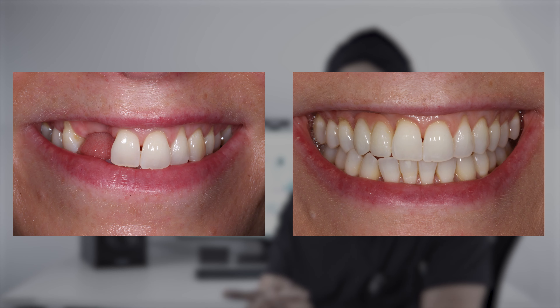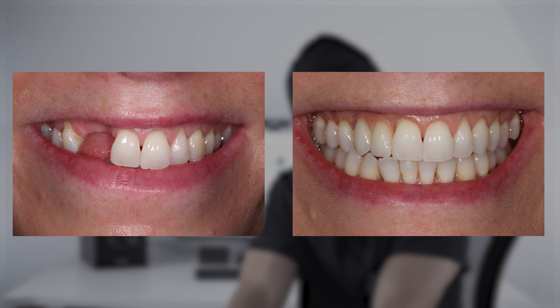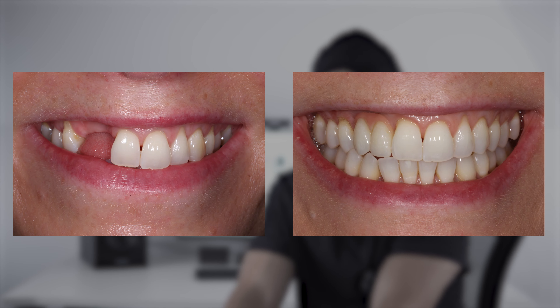How about when we're having a smaller treatment, let's say one or two dental implants — this can sometimes still be a problem. Let's look at this case in particular. This is a lady who we helped a little while ago and I saw her for a review earlier in the year. Her original situation, you can see here, she's missing these two teeth. It's at the front of her mouth. She's a young lady with a really wide smile.